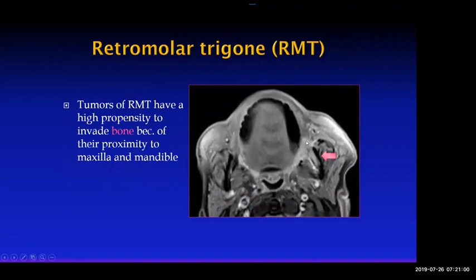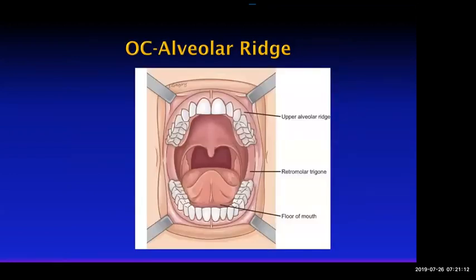Tumors of the retromolar trigone have a high propensity to invade bone because they're right adjacent to the maxilla and mandible, and so they tend to invade locally into the bone. You can also nicely see the retromolar trigone in its relationship to the back of the mandible on these images.